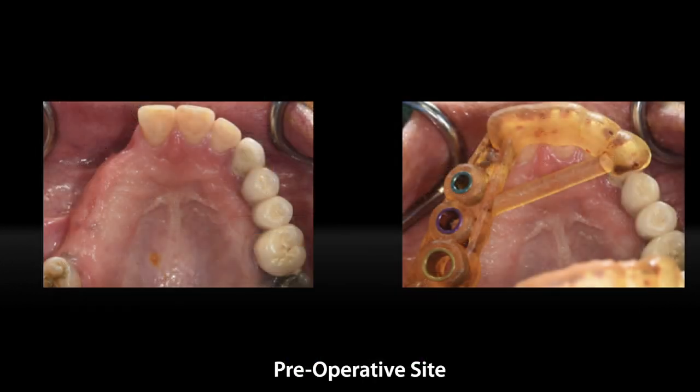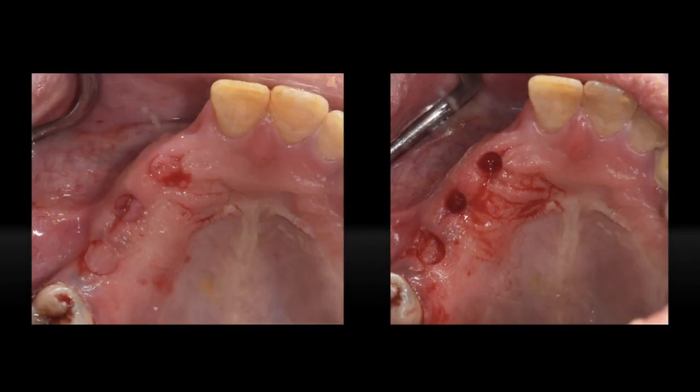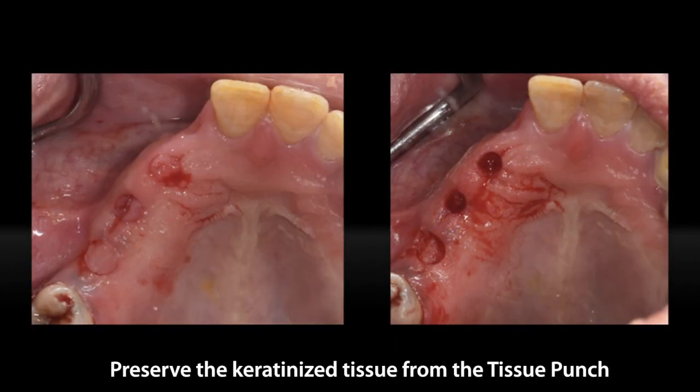Patient's pre-operative view, and the surgical guide is fitted well on the teeth. Tissue punch using the tissue punch instrument in the guided surgery kit. At this stage, it's better to preserve the keratinized tissue just in case you don't get good primary stability due to, for instance, low bone quality. So you can retain the keratinized tissue and proceed as a two-stage surgery.